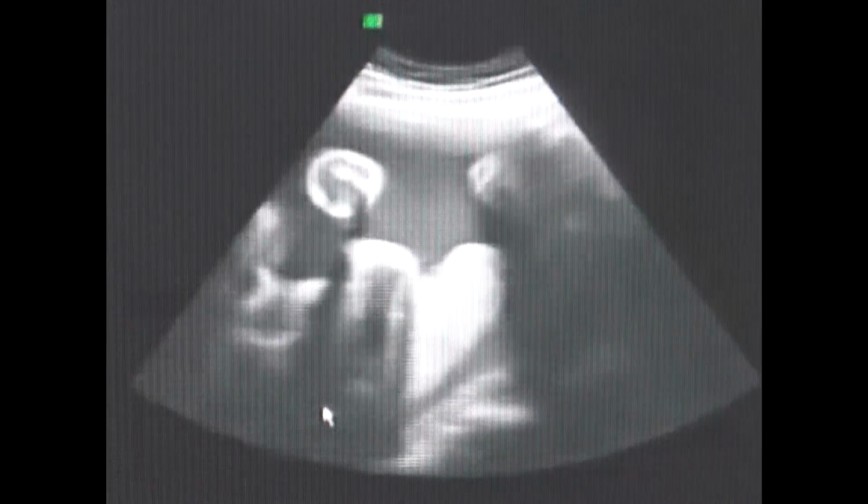What's all that? Her arm, her leg, her foot. Oh, she's actually holding on to her foot with her hand. It's hard to see, but that's what she's doing. These are her toes right here, and then this is her hand on the bottom of her foot. Her whole arm across her face. This is that arm right here. Her face is there. That's good.